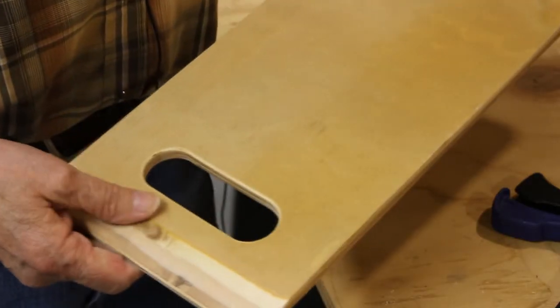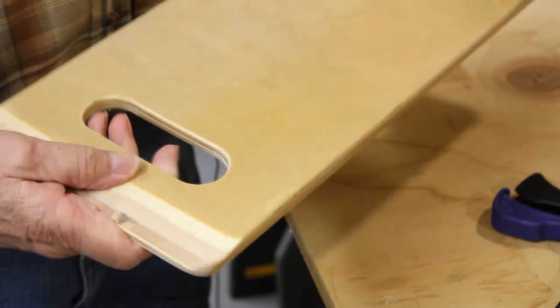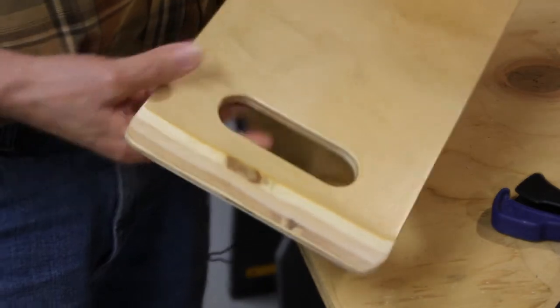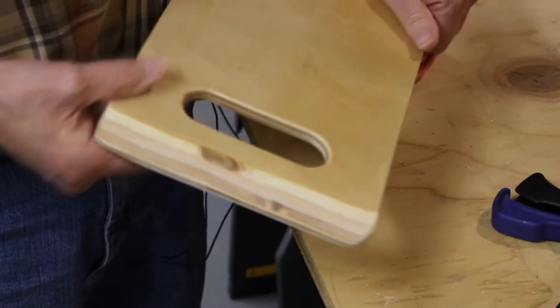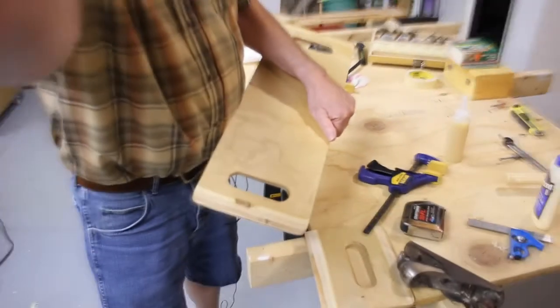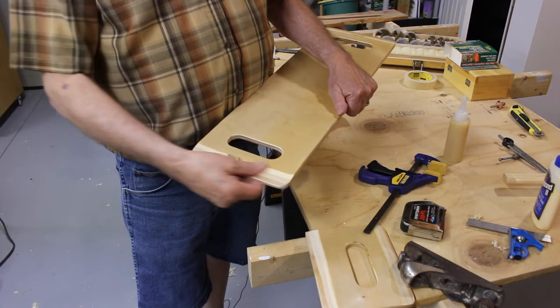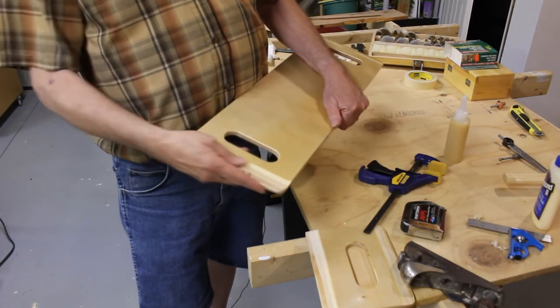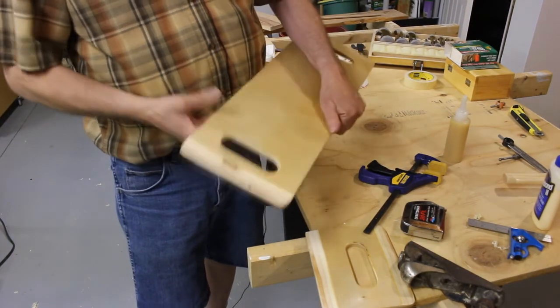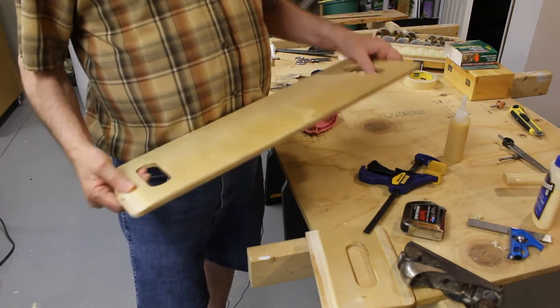I got the bevel on the end of the board. As you can see, I did it with my random orbital sander. I started out with 80 grit, then moved on to 100, then 240, and finished up with 320. Got a nice finish on it.